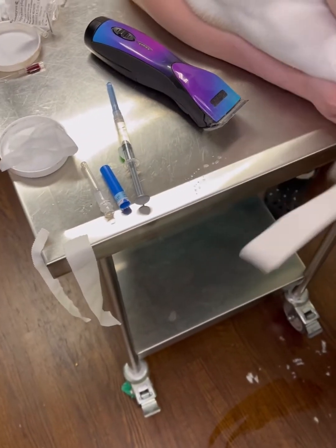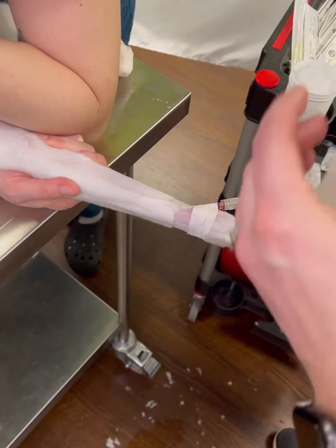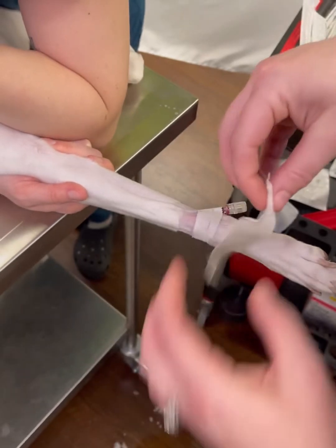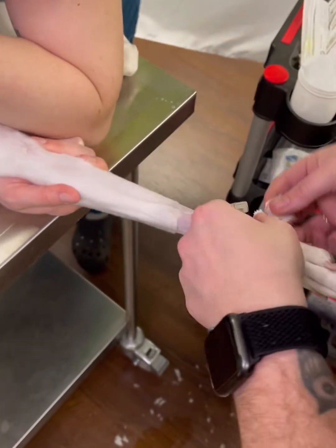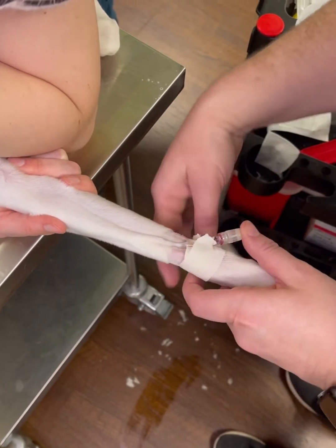Your next piece of tape is the thicker piece with a notch in it. You want to make sure your tape is tabbed. You're going to put the notch sticky side down under your catheter, taping around the catheter.